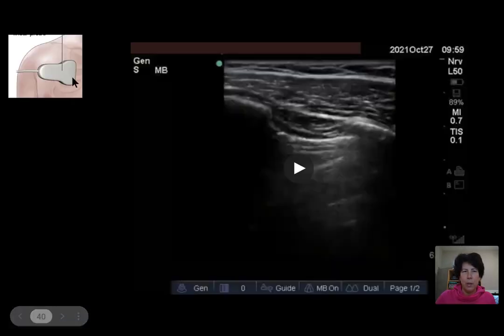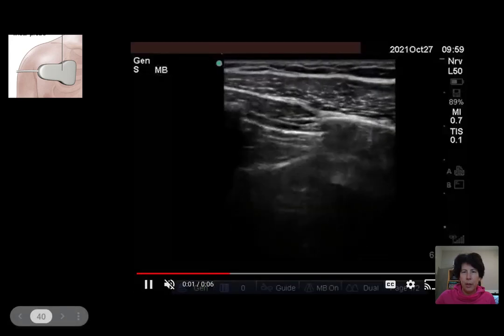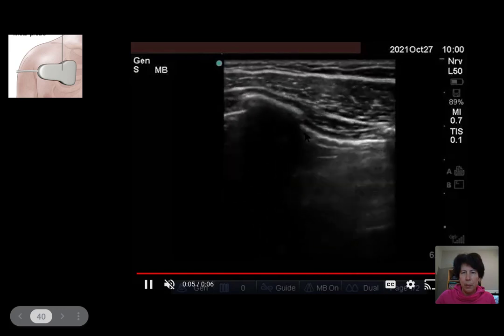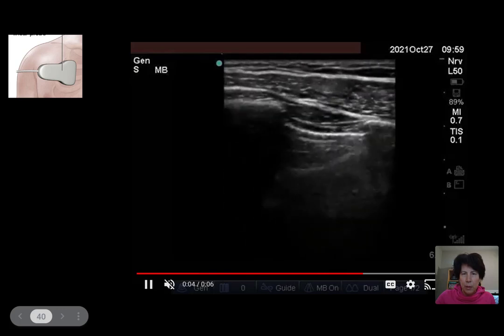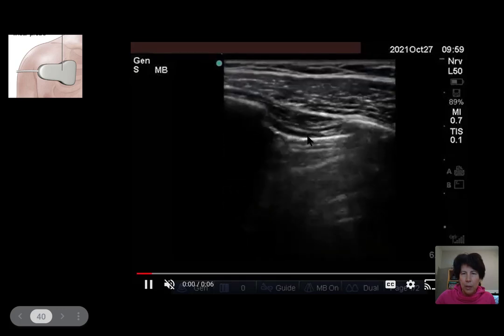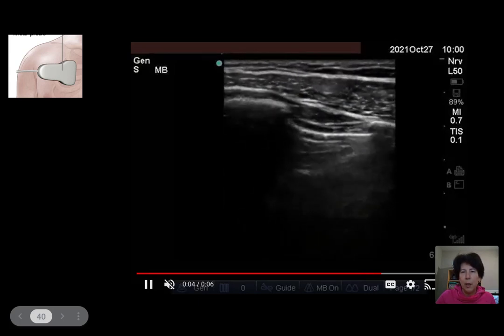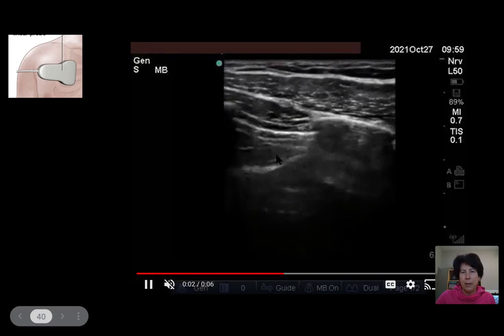So what does that look like? This will be a linear probe, spanning two rib sections. So here are our ribs. Now we're going to play it. Again, here are our ribs. This is our pleura, and keep an eye on this pleura. You're going to see these tiny little things that they call ants on a log. That's normal slide. And then you're going to see these reverberation artifacts. Those are the A-lines.